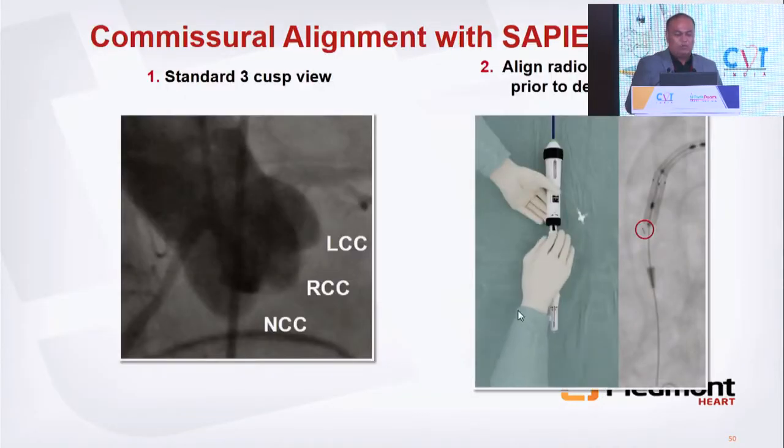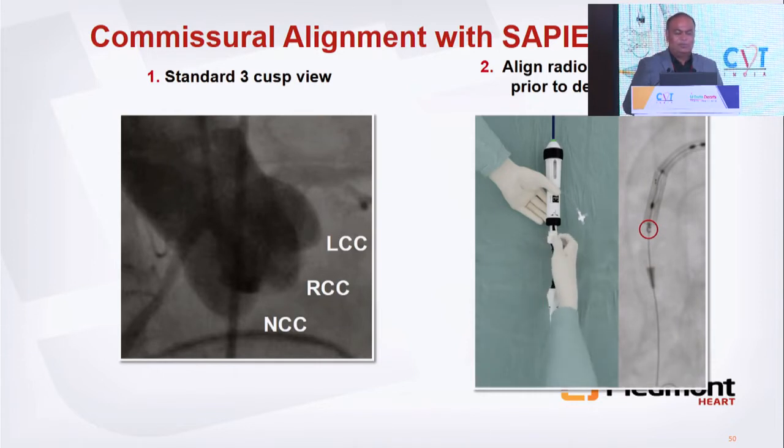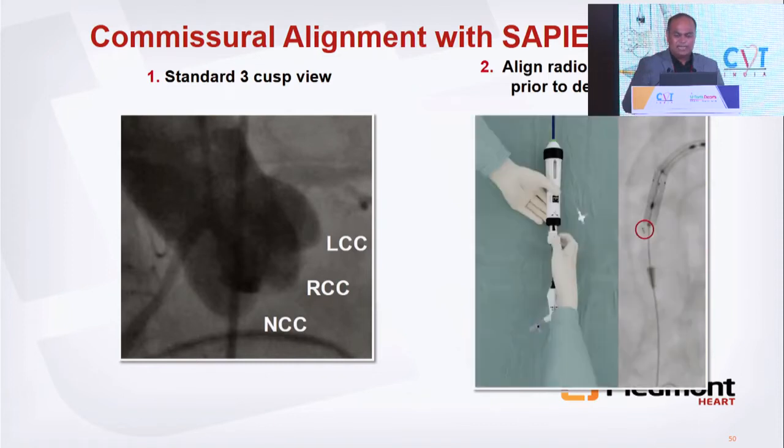How do you do that? Once you're in a coplanar view, unlock the valve and this back end, you rotate it. You see a little marker right there in that red dot? It's a C. You clock that back end, that C will come right on your guide wire. That's all you need to do. And that will make sure that you're perfectly commissurally aligned. You advance the valve in. I'll show you again. That marker is on the side. Sometimes it's already on the wire, but if it's not on the wire, a simple quarter turn on that back handle will bring that C on the wire. That's all you need to do.